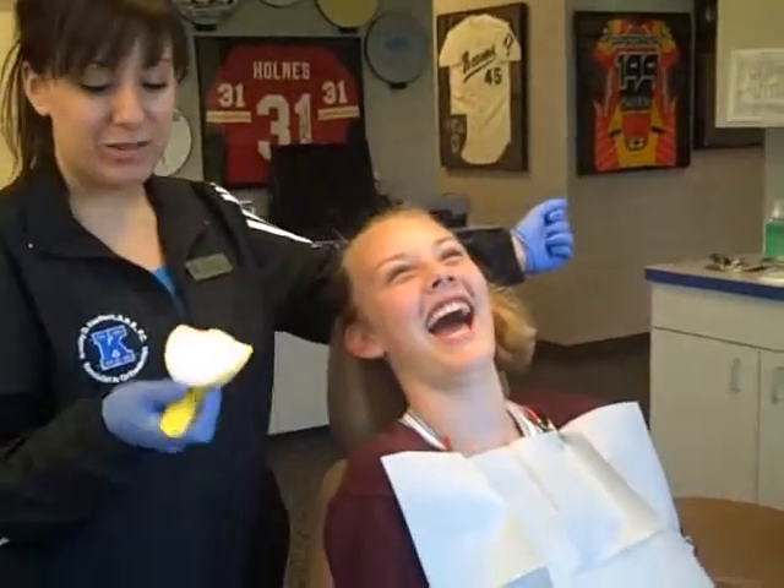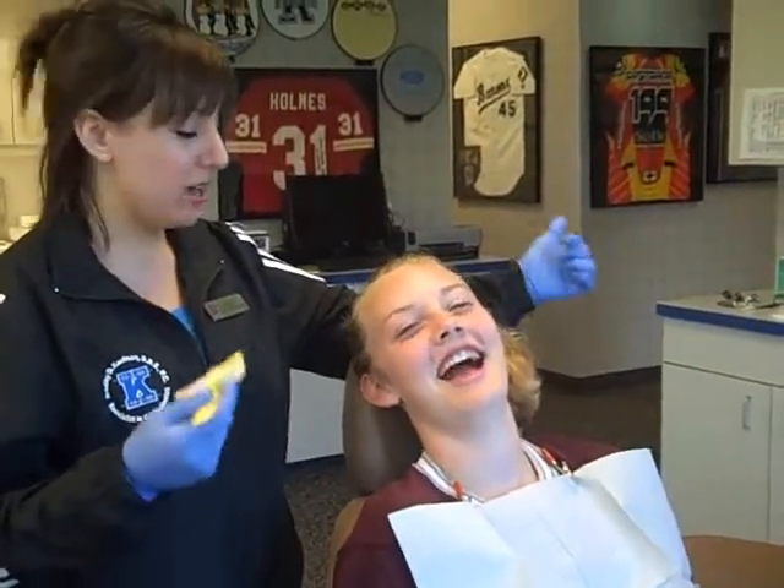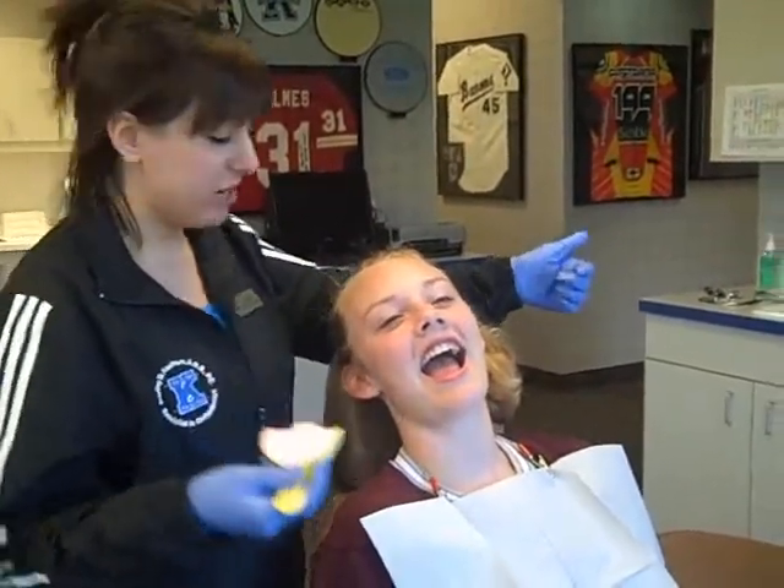They're giving me an impression for a retainer. It's a little bit of squishy, pudding-like material that we put into this tray. It sets up for about 30 seconds, and then we have our materials.